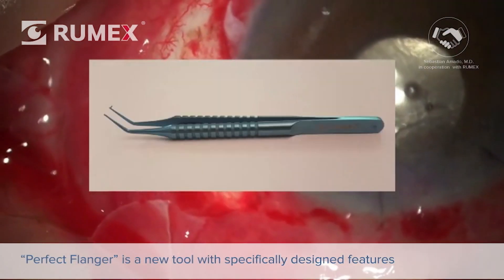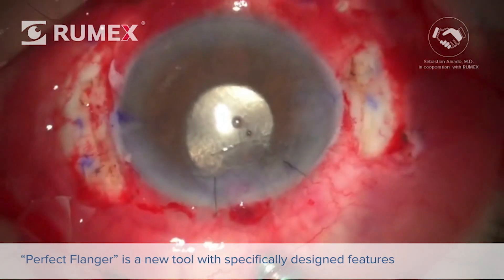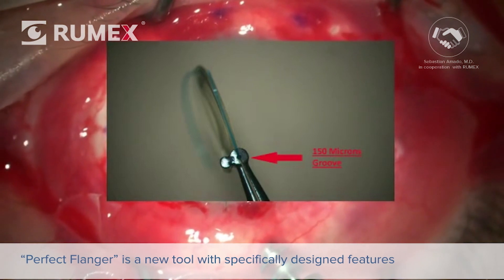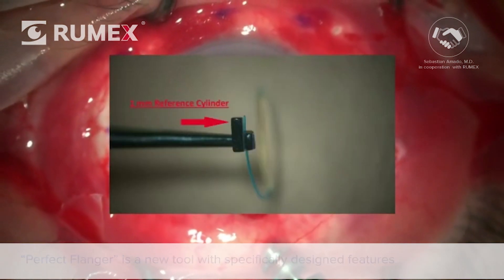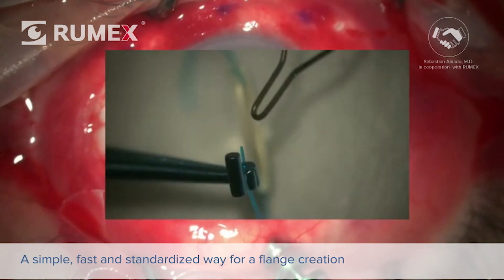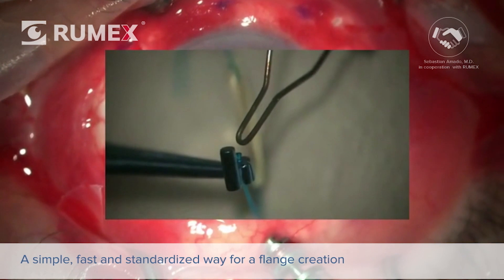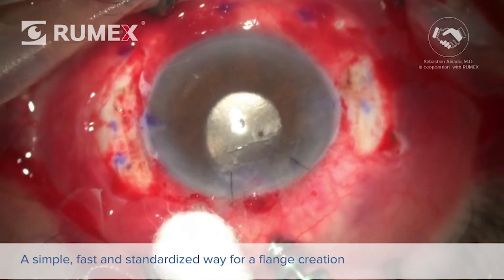In summary, the Perfect Flanger Forceps is a new tool for the anterior segment surgeon. Thanks to several specifically designed features, it allows for a simple, fast, and standardized way for flange creation when using sutureless scleral fixation techniques.